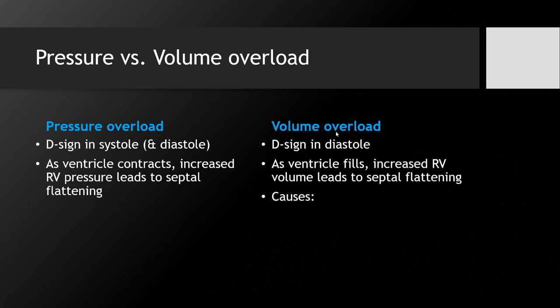a patient who we've over-resuscitated, a septic patient who got too much fluid. And that's possible. But there's also an ASD, tricuspid regurg, pulmonic regurg. There are things that can be going on intracardiac. So you can have intracardiac volume overload without having systemic volume overload. So this is not used to necessarily determine volume status on a patient. In the right clinical context, it might. It's important to recognize that the heart could be volume overloaded for any of several reasons. But the important point of this here also is to not just look at a D sign and say we have a D sign that's RV strain and go down your RV failure or acute RV failure algorithm. It's in order to really be able to distinguish the different types of RV dysfunction that you might be seeing.